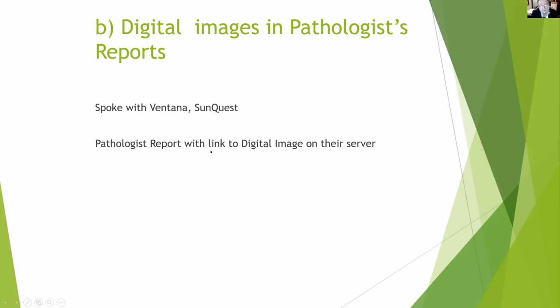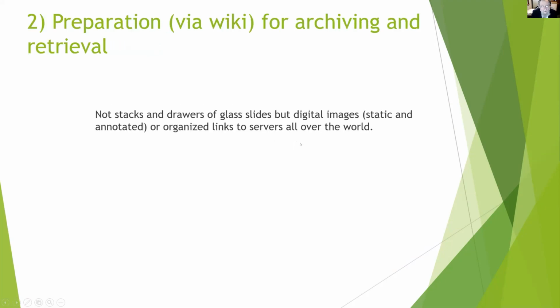But now, many of them are coming with a link to a digital image. So you click on the online pathologist report, you are transported in the way we have been describing to an image, and now it's a digital image, and you can zoom in and zoom out and go right, left, up, and down. And if you are so inclined and so trained, you can make your own judgment, or at least have something to discuss with the pathologist as to what you observe. So that was the first part, analyzing slides.